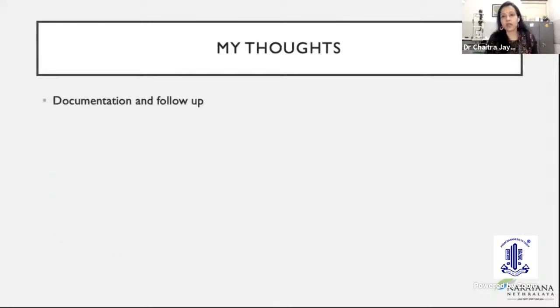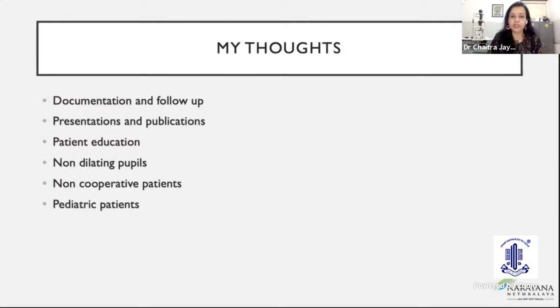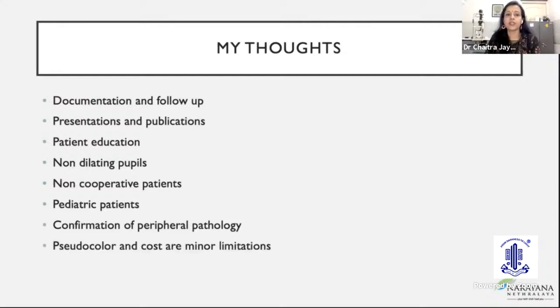And to end, my thoughts would be the documentation and follow-up is excellent. It does help me a lot, like in this presentation and for my publication, as a patient education tool. You know, the more said, the better. Non-dilating pupils, very easy. You can steer the eye and get better images. Non-cooperative patients as well. Pediatric patients, like I mentioned. Confirmation of retinal pathology in the periphery. And also minimal limitations are pseudocolor images that you get, and cost.